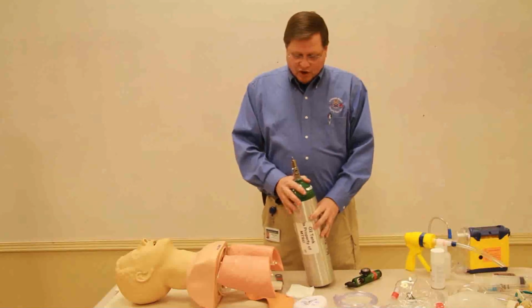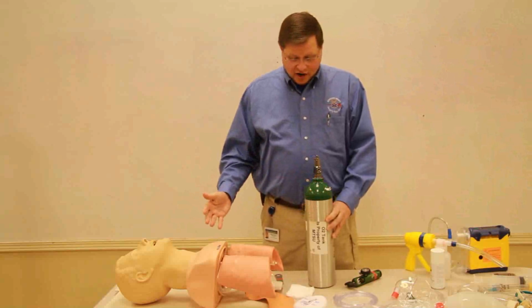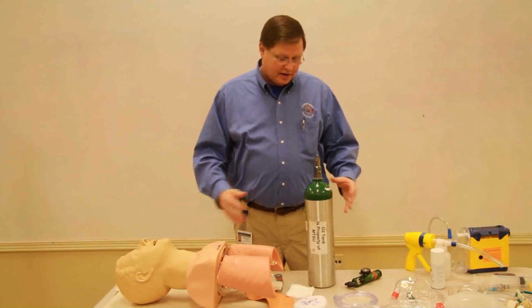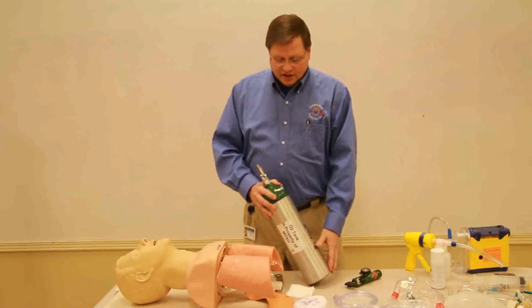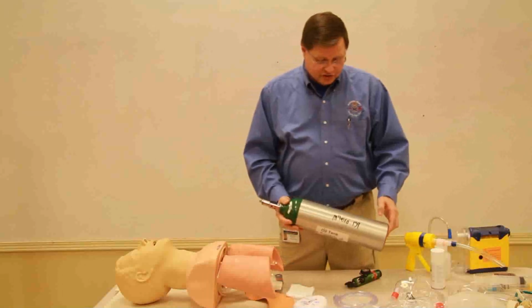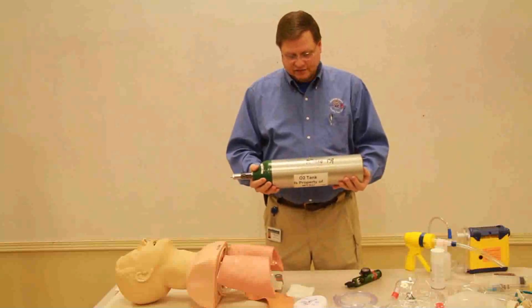So we never want to leave an oxygen tank unattended, and we never want to leave an oxygen tank just sitting up like this right here. So if we're going to leave, we want to make sure that it is on a stable surface that is being held and that it is down like this so that there's no chance of it falling.